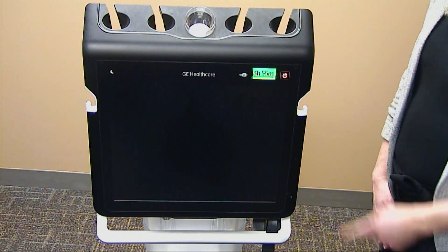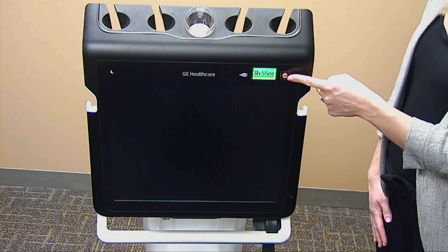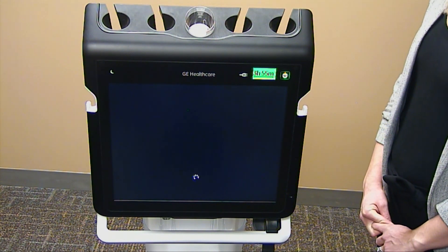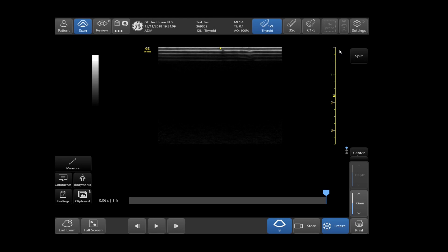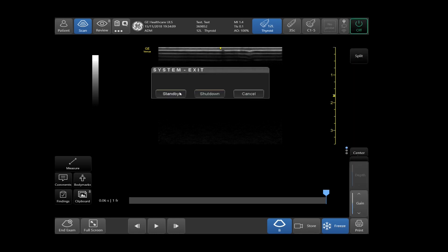To boot up your Venue, tap and hold on the power icon located in the top right-hand side of your touch screen. It will take up to 80 seconds to boot up. To shut down or place your system in standby mode, tap on settings located in the top right-hand side of the touch screen, then tap off. If standby is chosen, you can reboot the system in 6 seconds. When shutdown is selected, your system will reboot in less than 80 seconds.